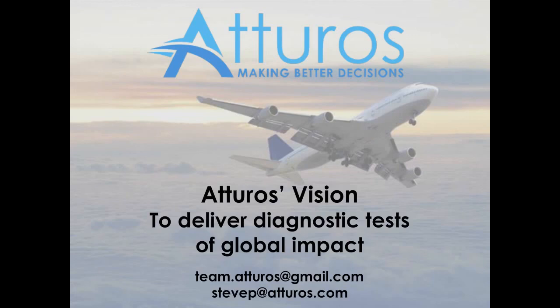Instead, they measure the relative levels of the transcripts and use an algorithm to derive a score or a numerical value for the combination of them. And I think that's something that we anticipate will be done in a similar fashion here, that we will measure the relative amounts of those peptides and then, using the algorithm that we've developed, produce a score. And it won't be necessary to analytically measure and quantify each of the peptides, and therefore we don't include isotope-labeled peptides.